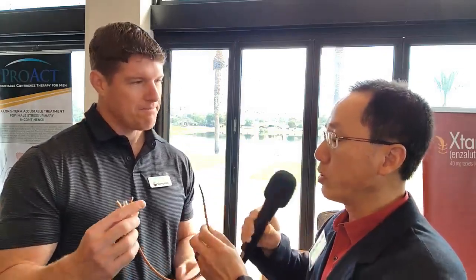It's a good question. ReTrace is fantastic. It's a single wire system as well. There's no ramp, so your wire runs in through the distal tip and out the eyelet. It's hard to see on video, but it just runs out with a simple bend of the device itself. Your distal tip here is 51 millimeters. Most other access sheaths are about 20, so this is a hydrophilic tip that acts more like a dilator. It is longer, so it makes it a little easier to insert.